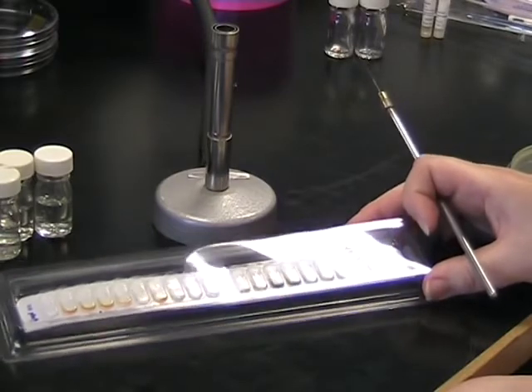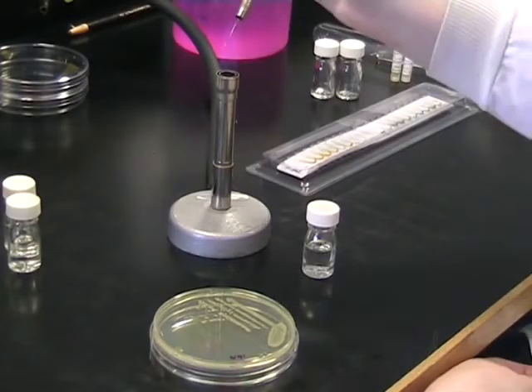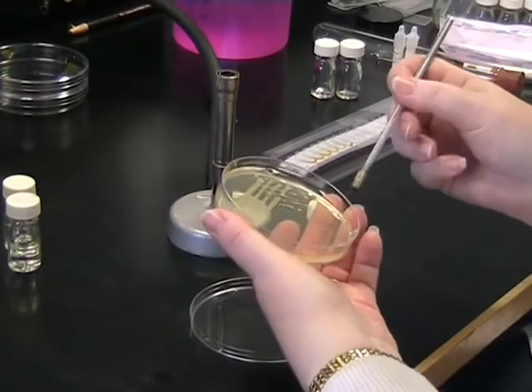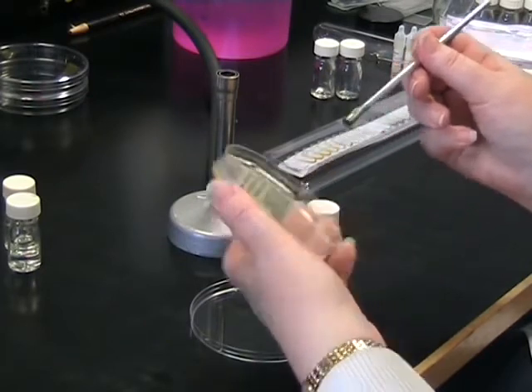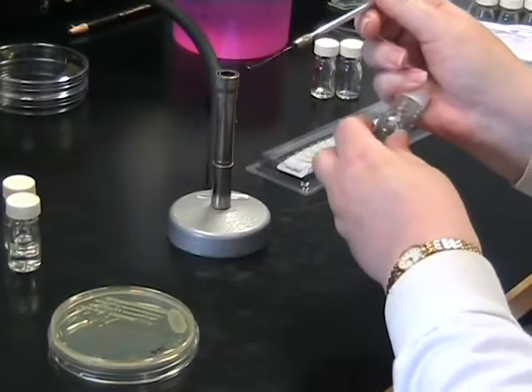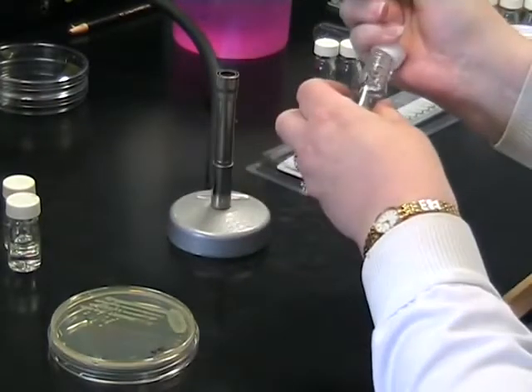First of all we need to prepare a sample to inoculate into these cupules. Flame your loop and take a sample of your unknown Enterobacteriaceae. Take 3-4 colonies and inoculate into 5ml of water or saline. Remember to flame the neck of your bottle as you go.